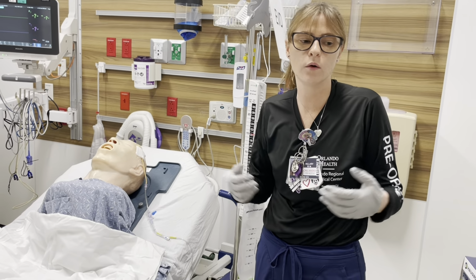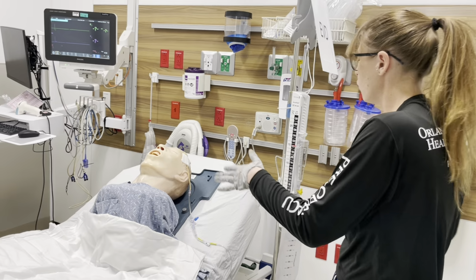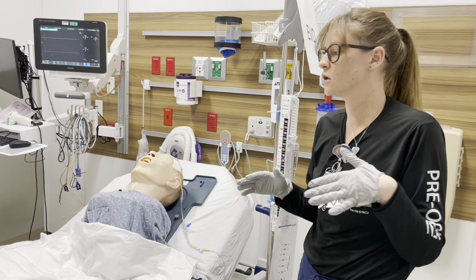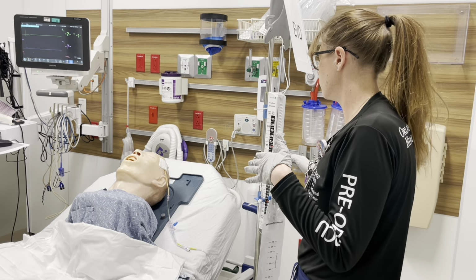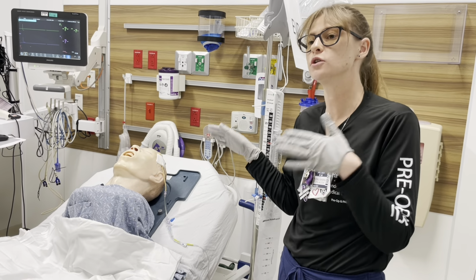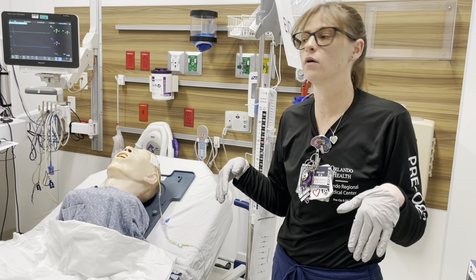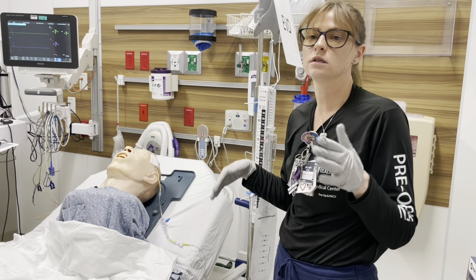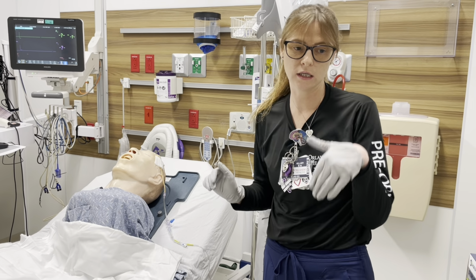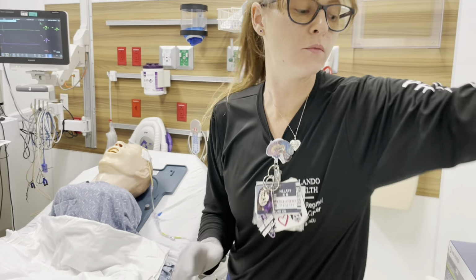At this point, we can start getting sterile. We are going to be opening things. We don't necessarily need to put on sterile gloves just yet, but it's a good idea, if you're getting ready, to go ahead and get your cap on, get your mask on, get your patient's mask on, get your gown on, so that your patient isn't coughing on what you're doing over here, and so that everybody's staying all nice and clean. So we'll go ahead and do that now.